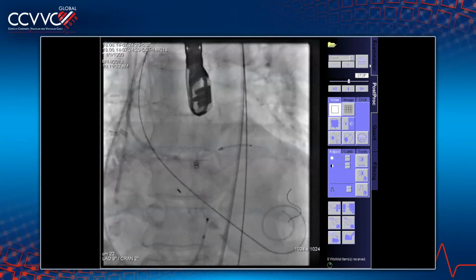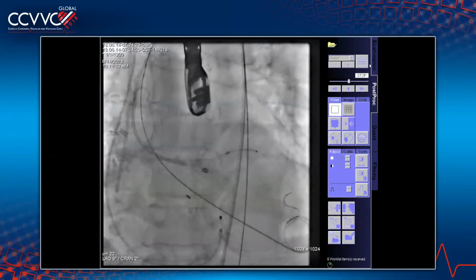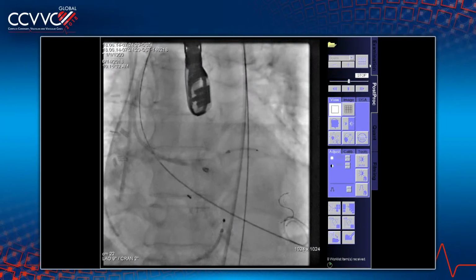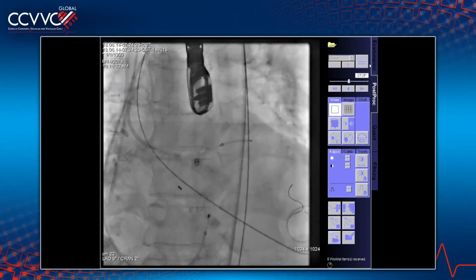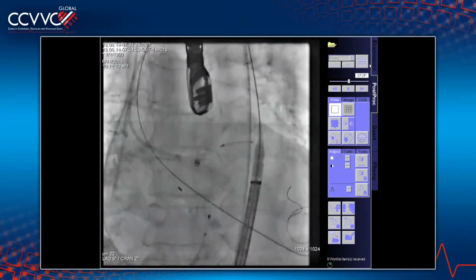Yeah, we have a guideliner with a stent. I think the guideliner here is a very smart move in protecting it as well. And I think if we have the Evolut valve, then you definitely need the guideliner. If you are using the SAPIEN, you do not need the guideliner if you are protecting the left main. So we're going up all the way.